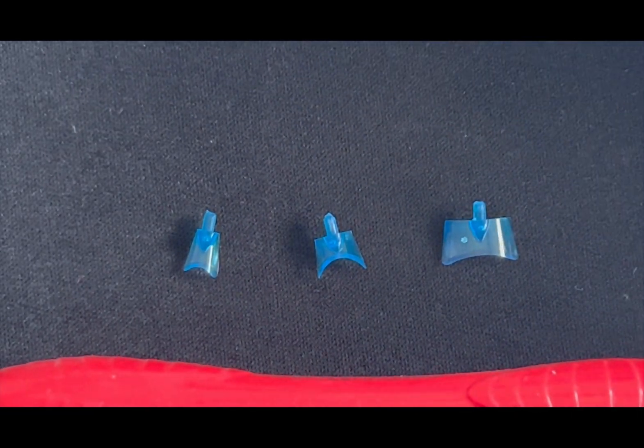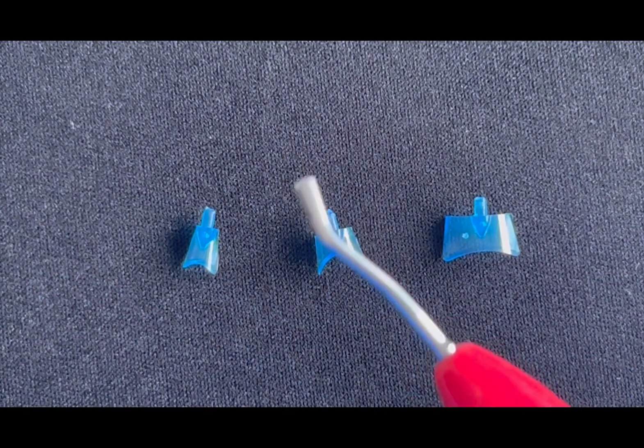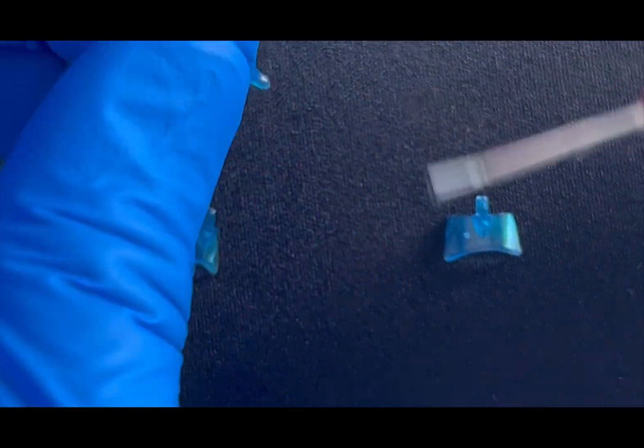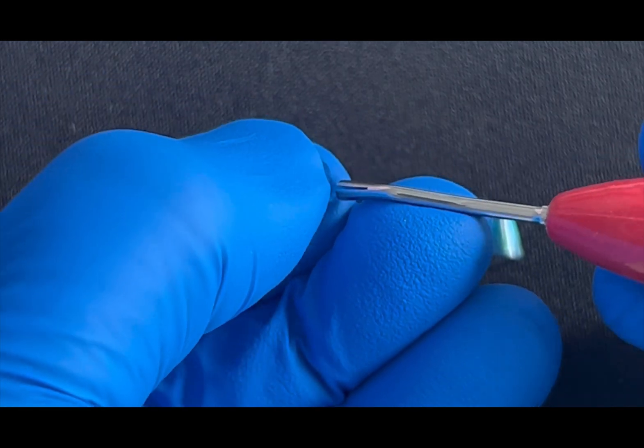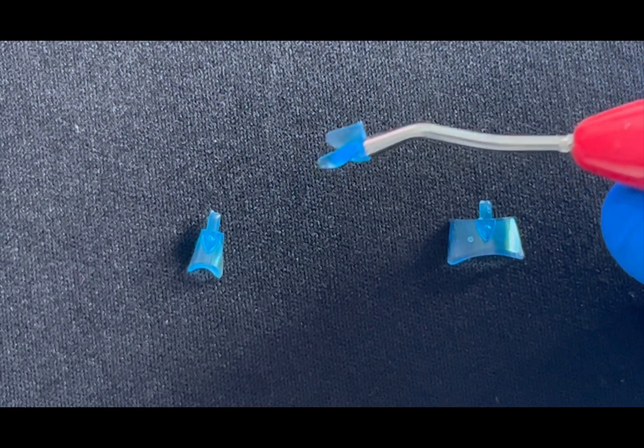For example, if I want to isolate the upper anteriors, I use the medium tip and I fit it like this.